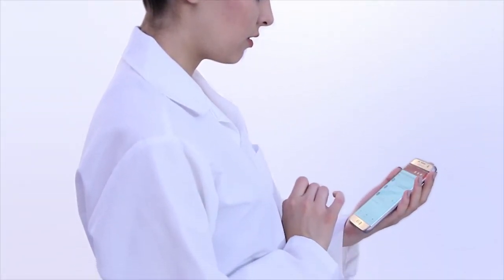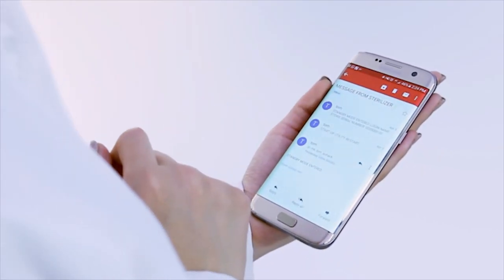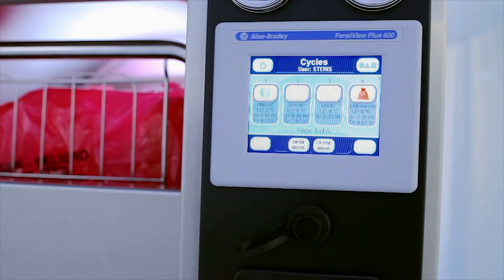Stay connected to what is happening in the laboratory with your AMSCO Medium LS sterilizer by receiving emails or text alerts as to the status of the equipment. The sterilizer can also be interfaced with and monitored by your building management system if desired.